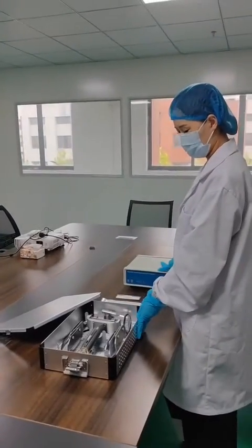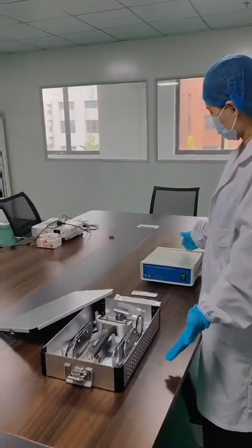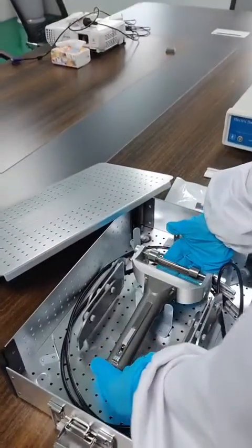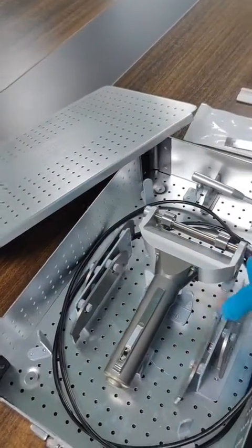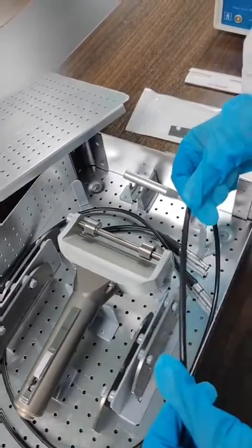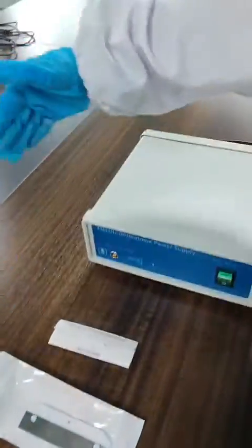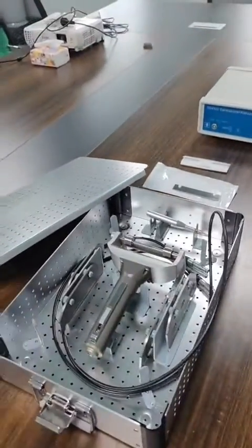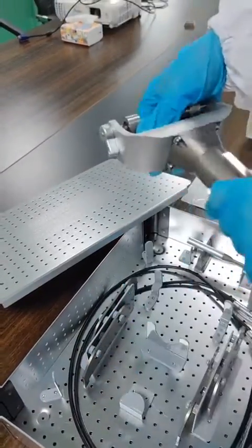Hello everyone, let's introduce our electric dermatome to you. Firstly, check the components: handpiece with blades, handpiece cord, screwdriver, blades, power supply, power cord, and an autoclave case. These parts need to be sterilized before use.